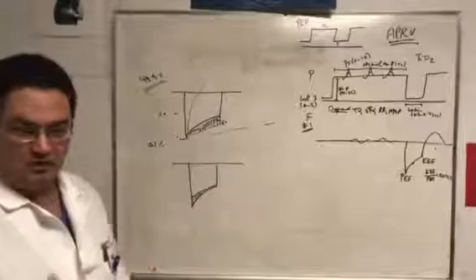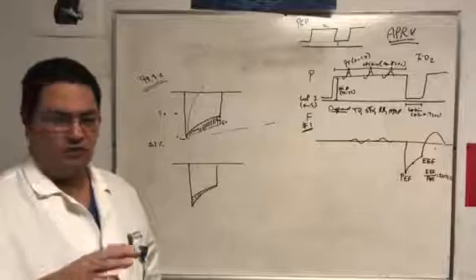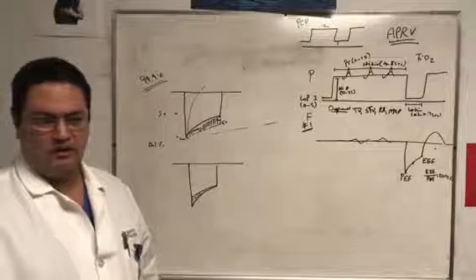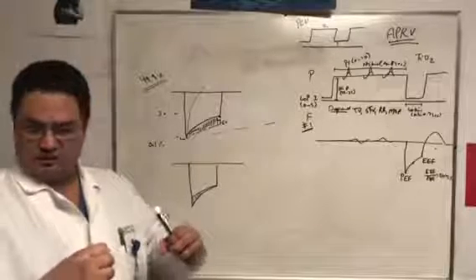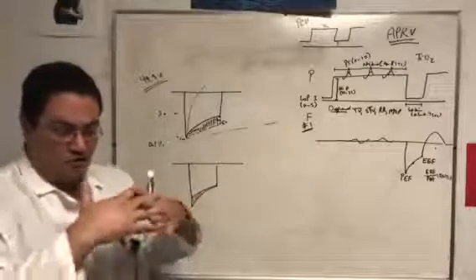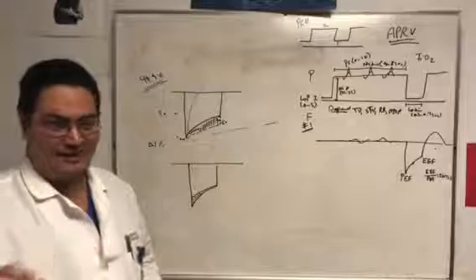except in 0.1% of the time, because what does the pulmonologist do when it comes to an asthmatic patient? A resistant asthmatic patient in the ER, that is, we tried everything, all medications, all interventions, intubated, blah, blah. What do we do? The last thing that you do for an asthmatic patient to improve their bronchospasm is to increase the PEEP, right? By increasing the PEEP, you keep these bronchi open a little bit, keep them from constricting. And it's true, you keep more PEEP inside. The bronchi want to constrict chemically inside, the troponin and the tropomyosin and all, trying to pull, but it can't, because there's some more pressure inside, so it can't constrict. So that's increasing the PEEP from 5 to 8, 5 to 10.